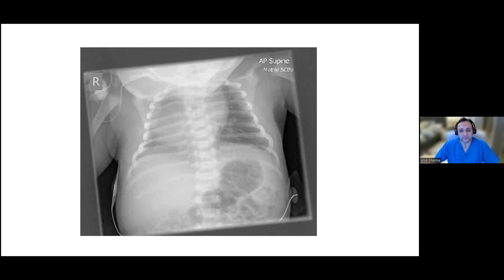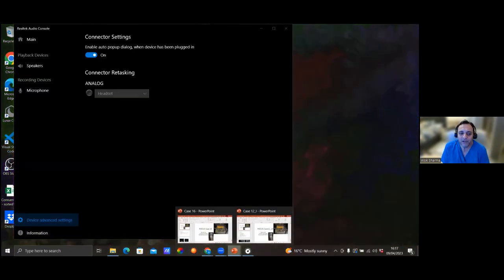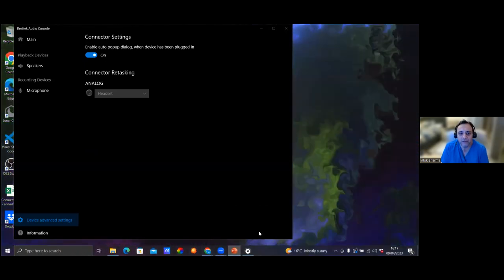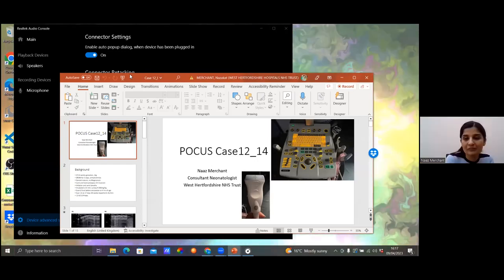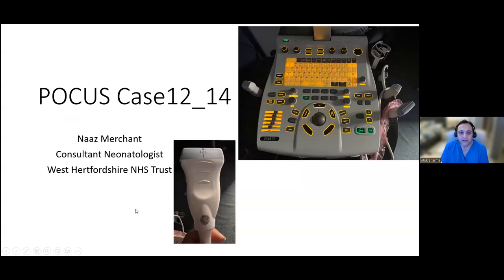So I'm just giving everybody a small feel of POCUS. About 8 years back I did an echo on a baby to look at situs. We did the echo to assess the duct, which was massive, started some paracetamol, and re-echoed the duct 3 days later. Unfortunately, I could not get a view of the situs or the aorta, nor the relation of the aorta.